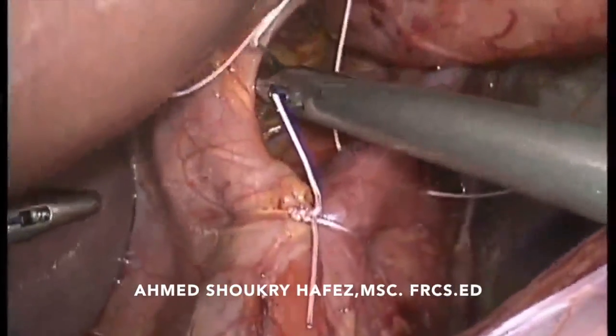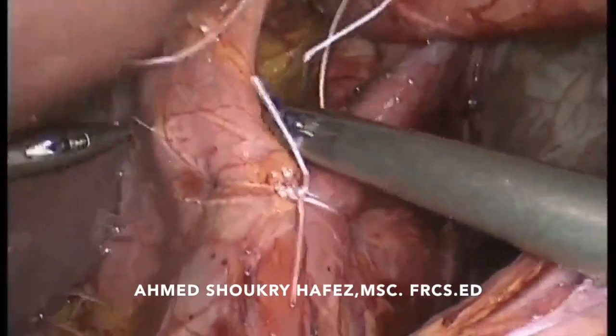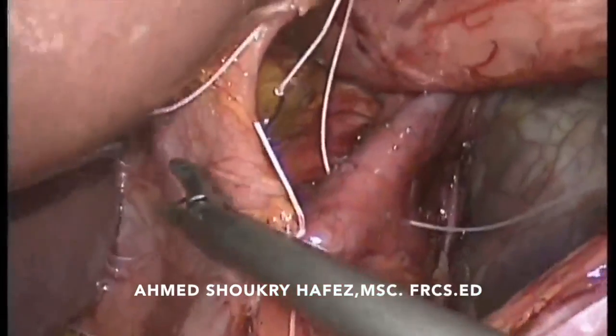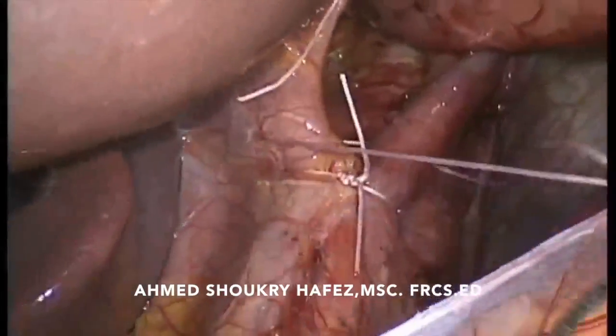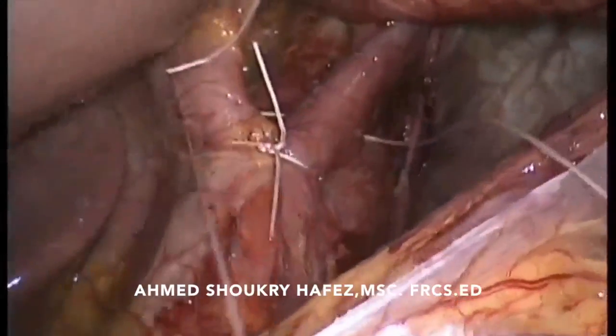Be careful of the back of the needle as you are careful with the tip of the needle. The back of the needle can injure the esophagus or other important structures.